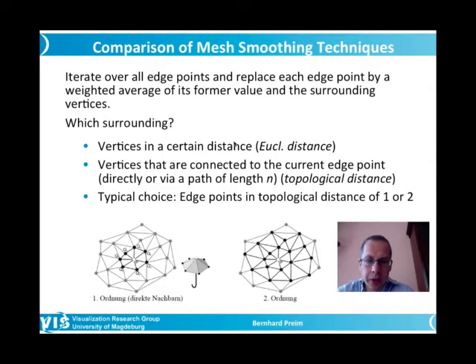Smoothing algorithms that we considered were all local. That is in contrast to the methods I just mentioned a minute before, where total curvature is minimized. These are global methods. But global methods take a lot of time. Local methods are faster, like marching cubes is a local method. So when you want to use a local method, the question is how local it should be.